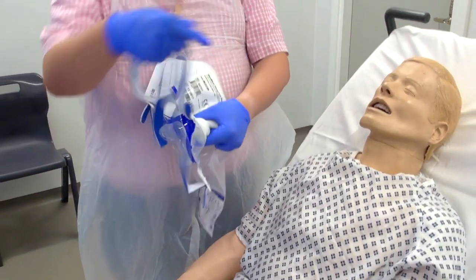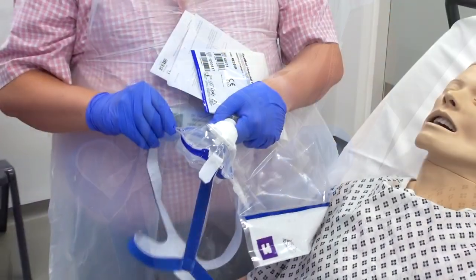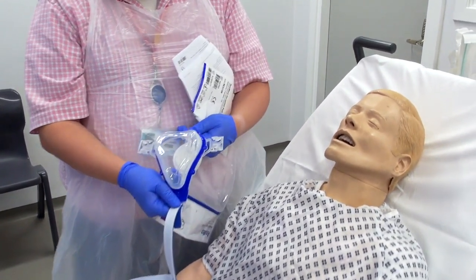Now I'll give you the mask with the strap. Undo the clips so it's ready to go on the patient when you're ready to start the non-invasive.